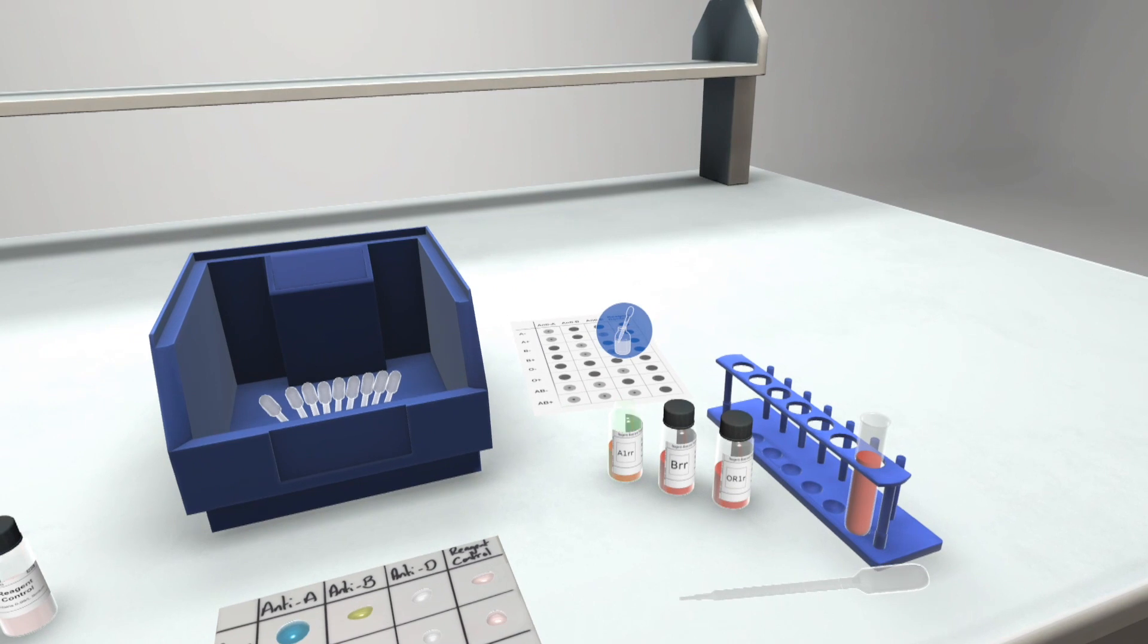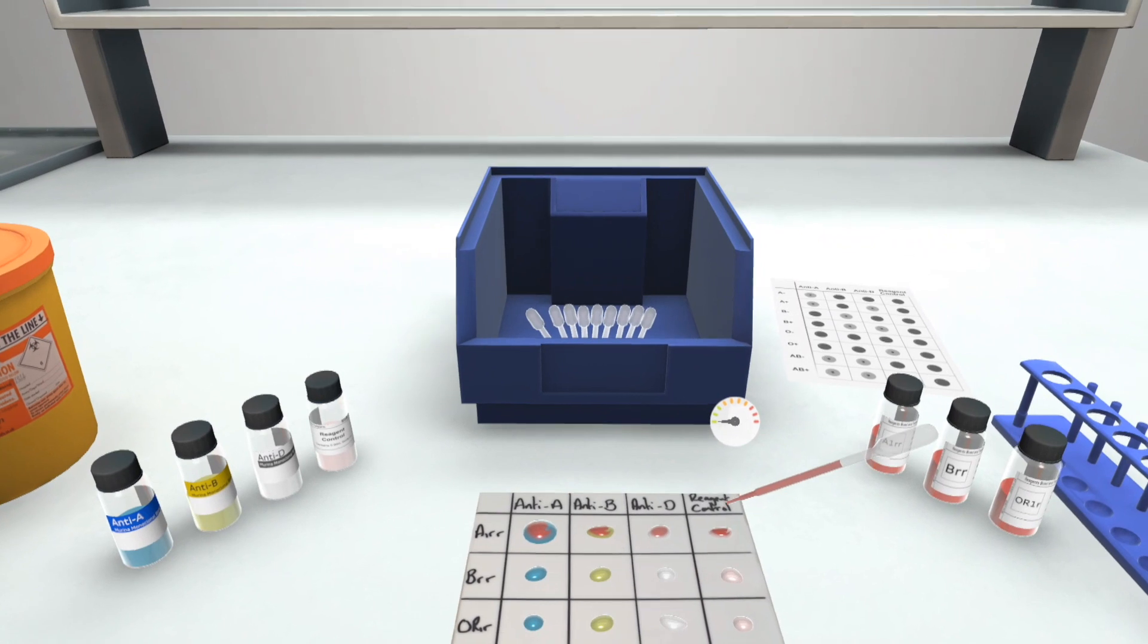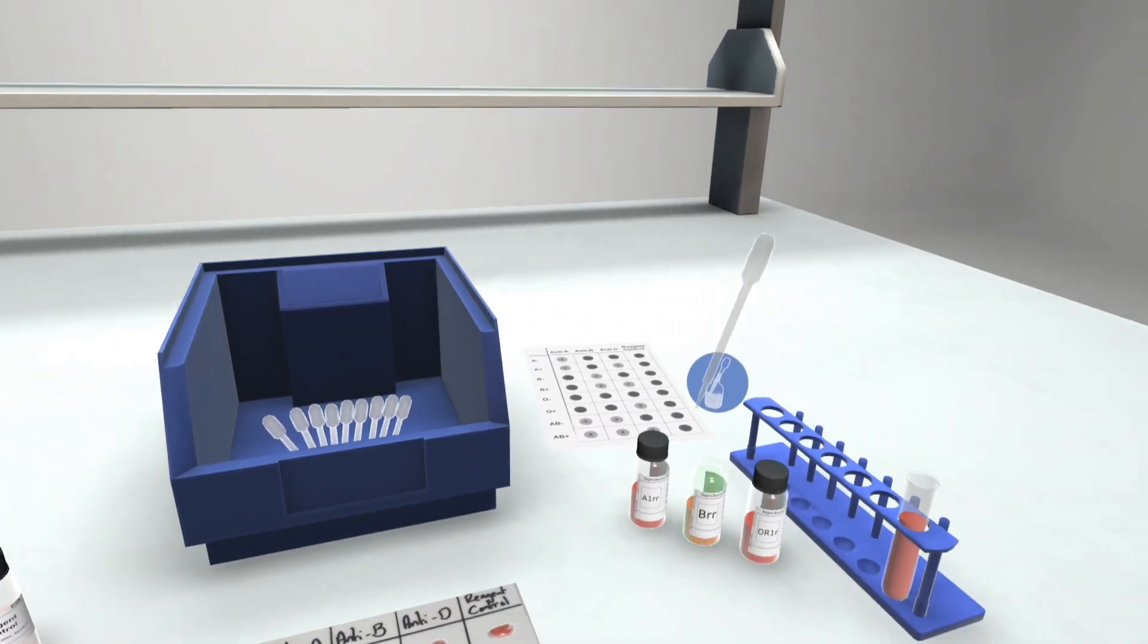When performing this process in real life, you'll need to mix the RBCs by gently rolling the bottles between the palms of your hands. However, we'll assume this has already happened.